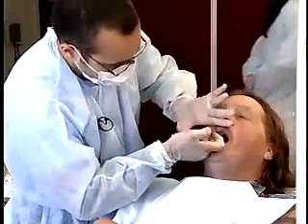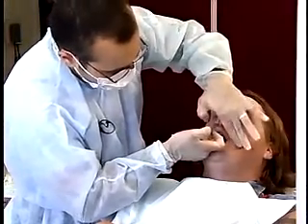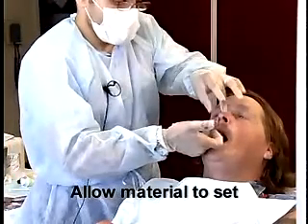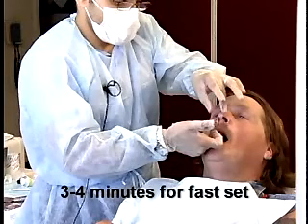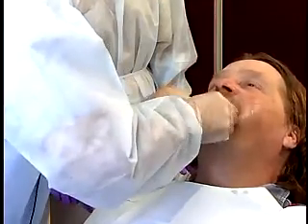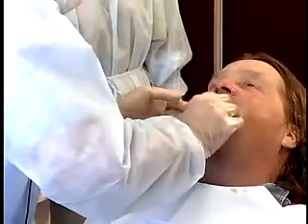Retain the tray in position with finger pressure at all times. Allow the material to set. Generally, this is 3 to 4 minutes for fast set rubber base and 7 to 8 minutes for regular set rubber base. Remove the maxillary final impression.